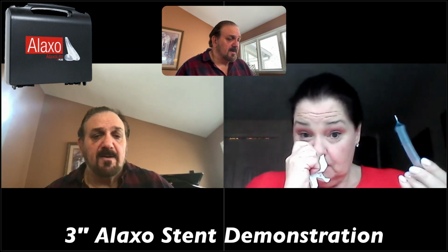Spray it all, let it sit for a minute so it can penetrate the mucus. Then just air dry at that point. If you want to rinse it off after that, you can. I do, because I always like to make sure that everything's gone, and then you just let it air dry, take it off and pop it back in your case. Yes. Okay. Fantastic.